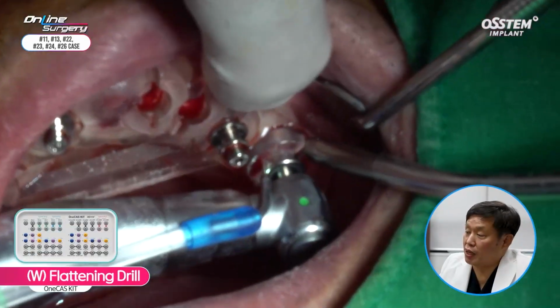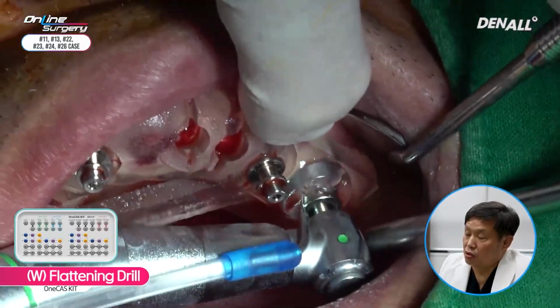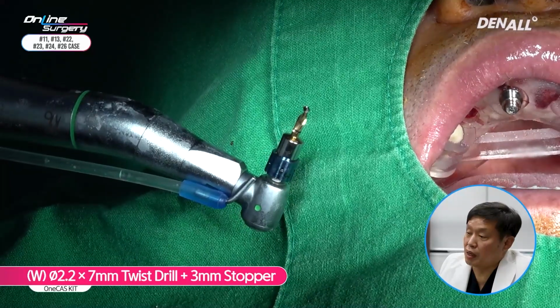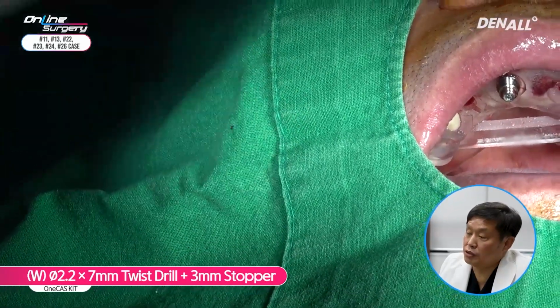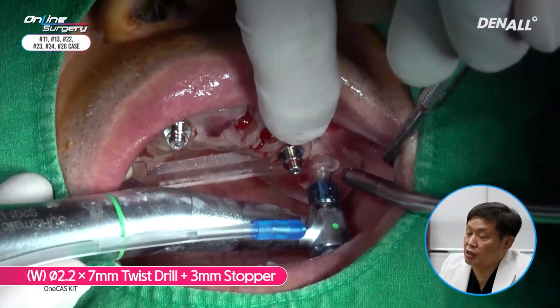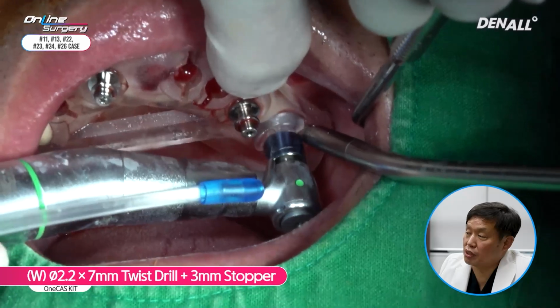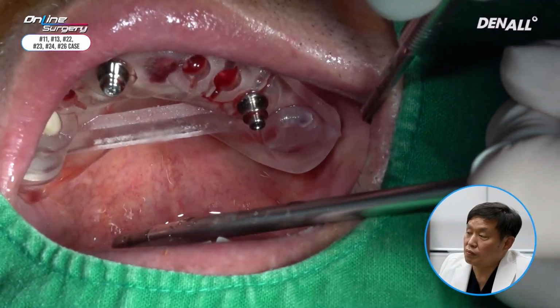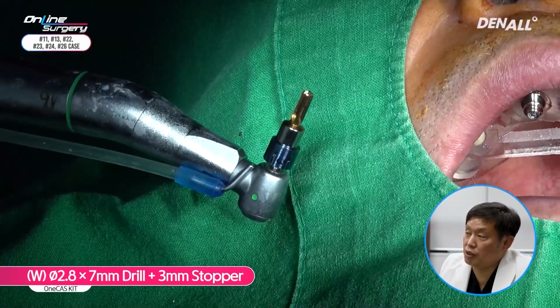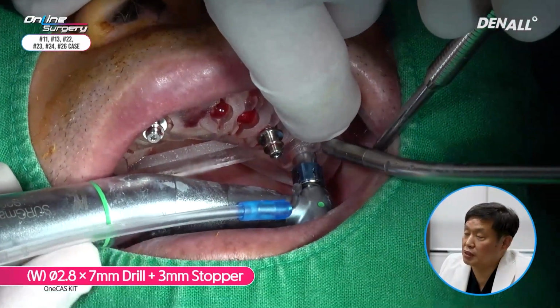Moving on to number 26. The flattening drill with gold rim was used to do flattening. A 3 millimeter stopper was used because it was assumed to be 5 millimeter. A 2.2 twisted drill with a 3 millimeter stopper was used to drill 4 millimeters, followed by 2.8 by 7 millimeter with a 3 millimeter stopper. In other words, a 4 millimeter drilling was done.